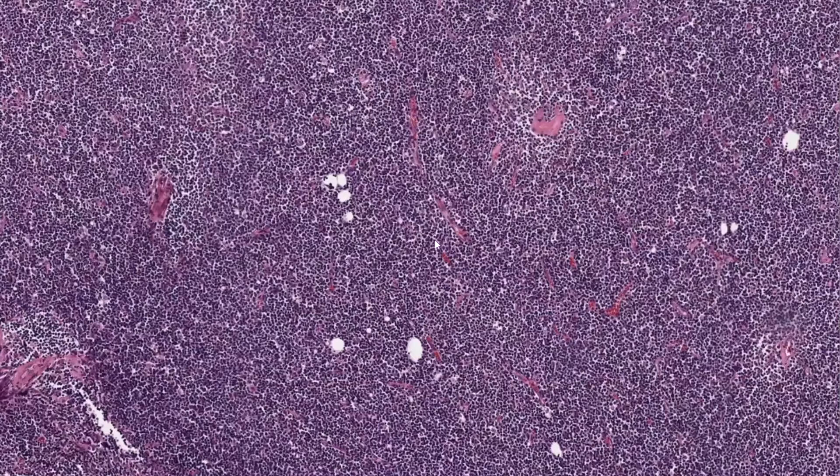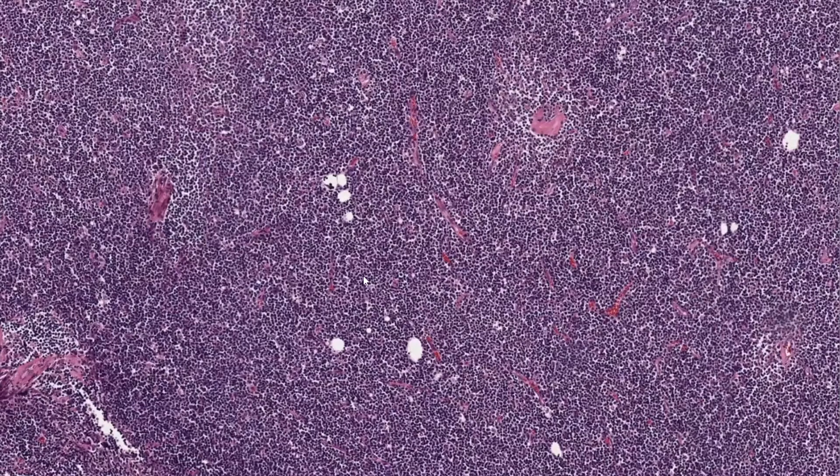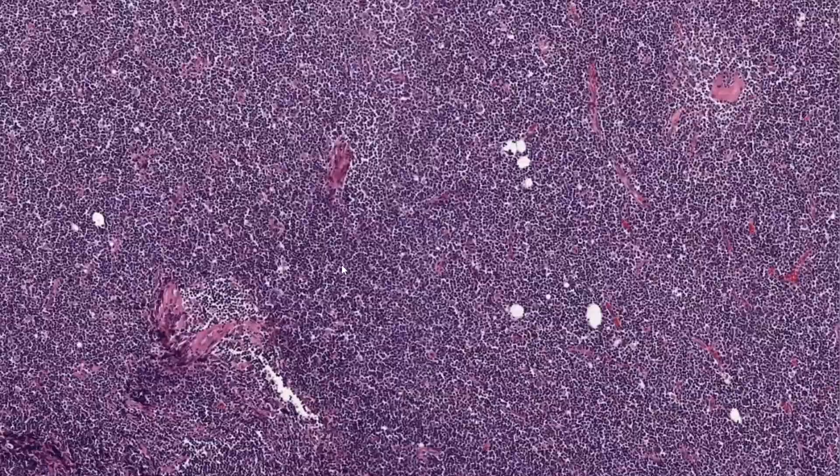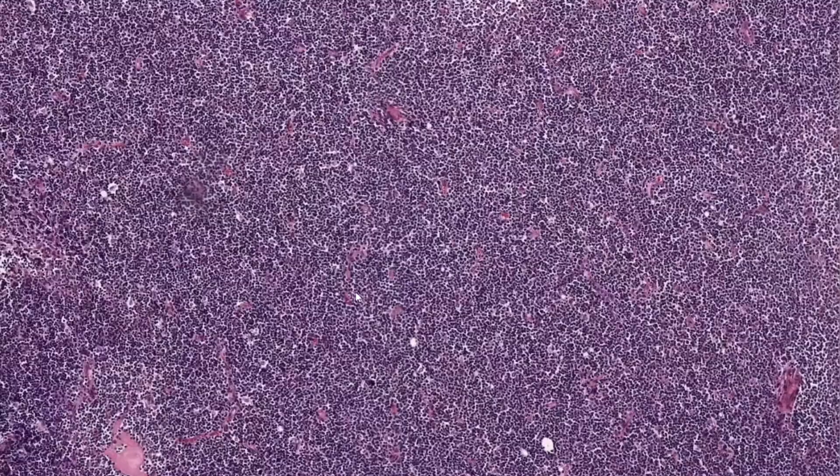There are also preserved areas of more medullary differentiation that are seen typically in B1 thymomas. A cytokeratin stain can be really helpful in these cases, as in thymomas it will show a dense meshwork of staining which you would not see in normal thymic tissue — you just see a patchy wispy staining in normal thymus. All these lymphocytes will be TDT positive as well, which can also help you.